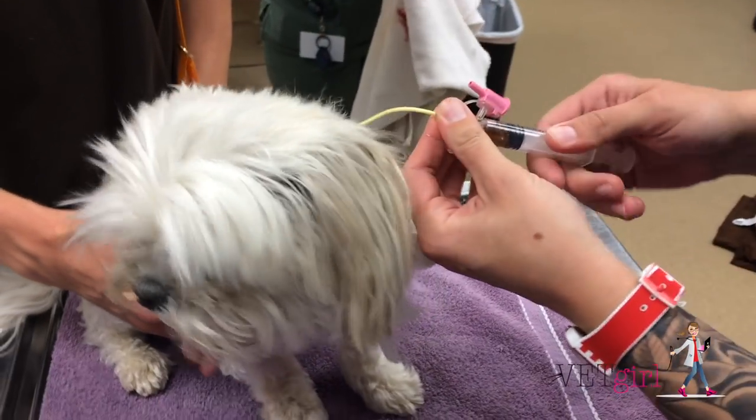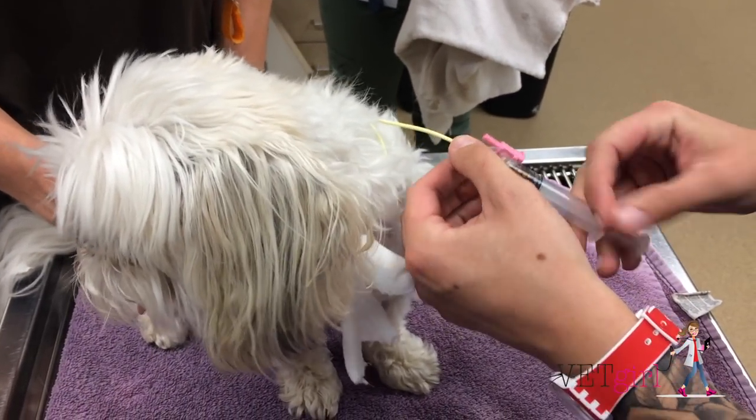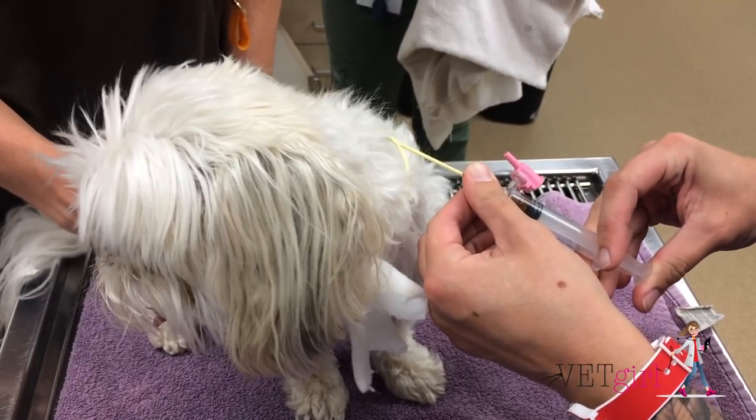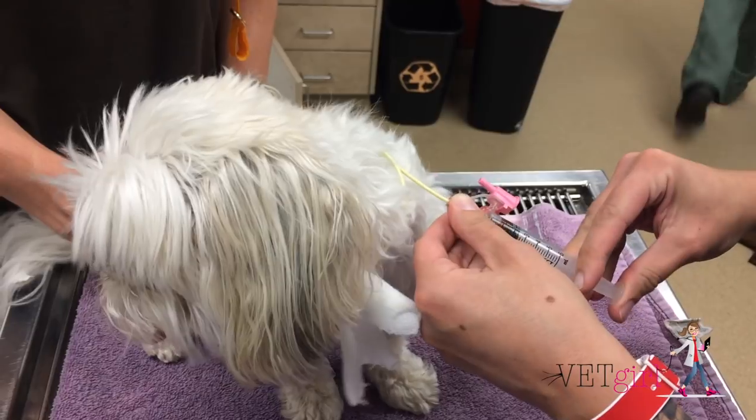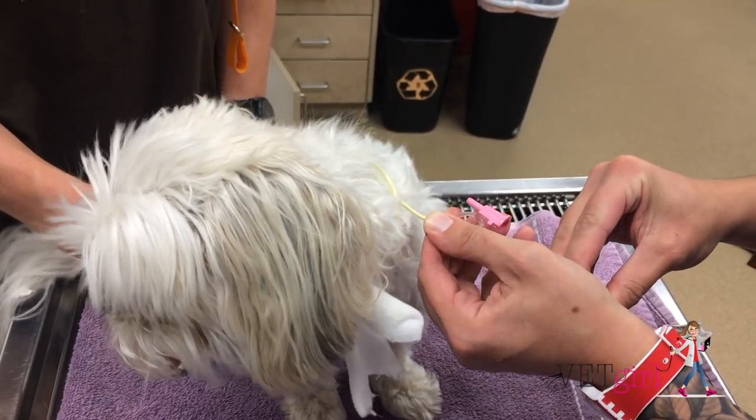If in the event that the tube occludes, you can easily use the old Coke technique. First, know that there's a reason why you shouldn't drink soda — the acidic nature of these drinks can eat through clogged feeding tubes.